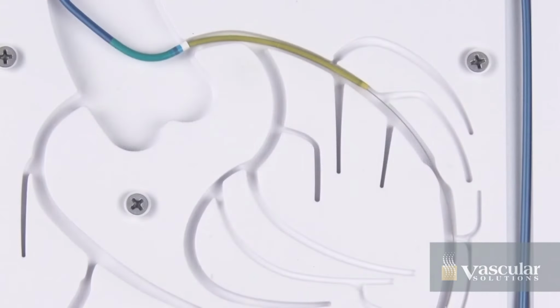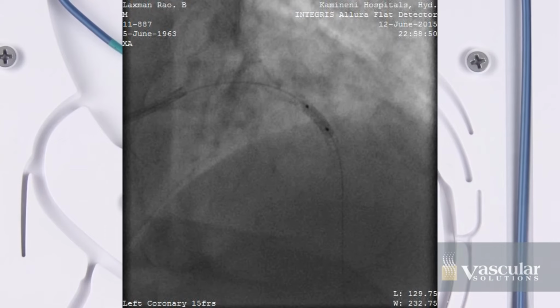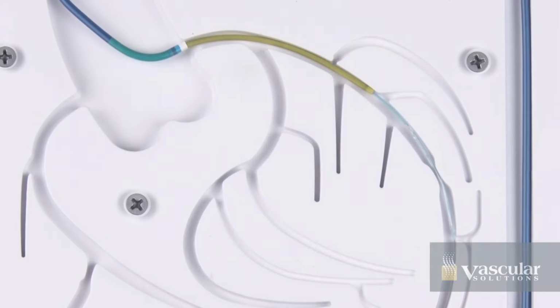If performing an interventional procedure, backload the interventional device over the existing guide wire and advance the device through the guide catheter and GuideLiner catheter into the desired vascular space. Tighten the Y-adapter hemostasis valve securely on the proximal shaft of the GuideLiner to prevent back bleeding.